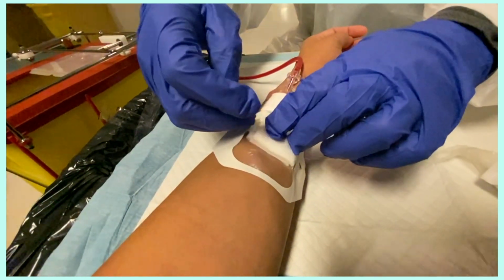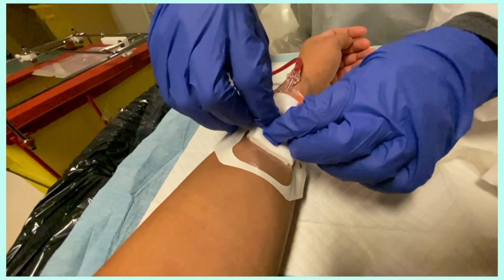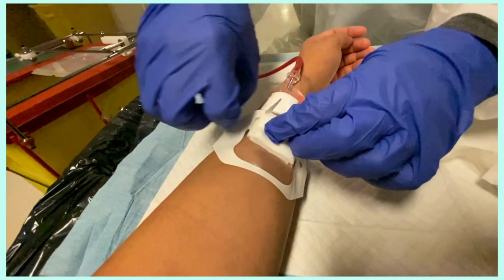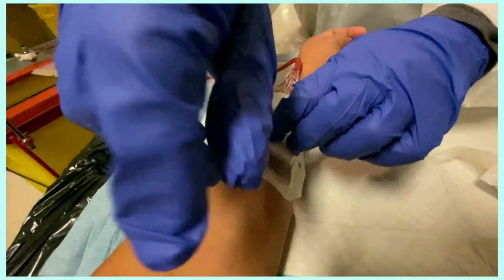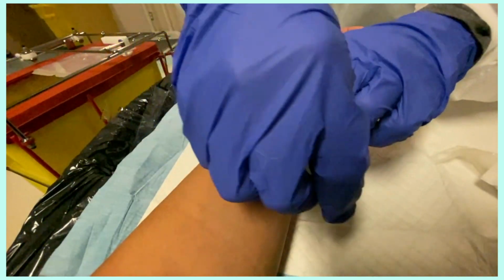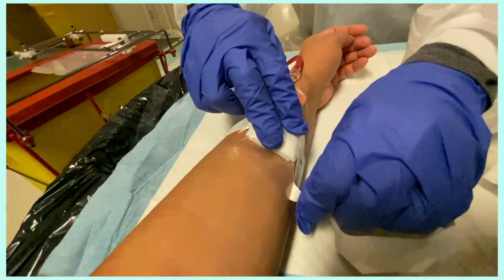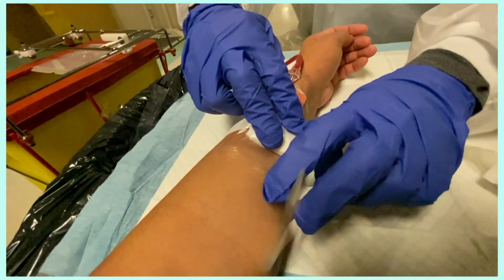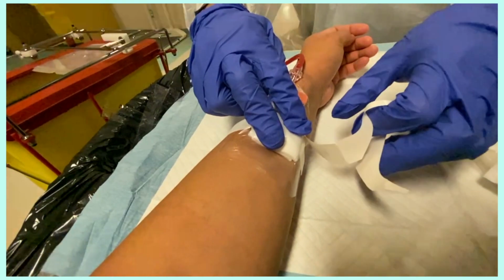But yeah, anyways, after she takes the needle out, she keeps on holding the exit site because you don't want to bleed out. And after she's done all of that, she gives it to you, or he gives it to you, and you have to hold it while she works on, or he works on, the second needle. And then you have to hold it for 10 minutes.